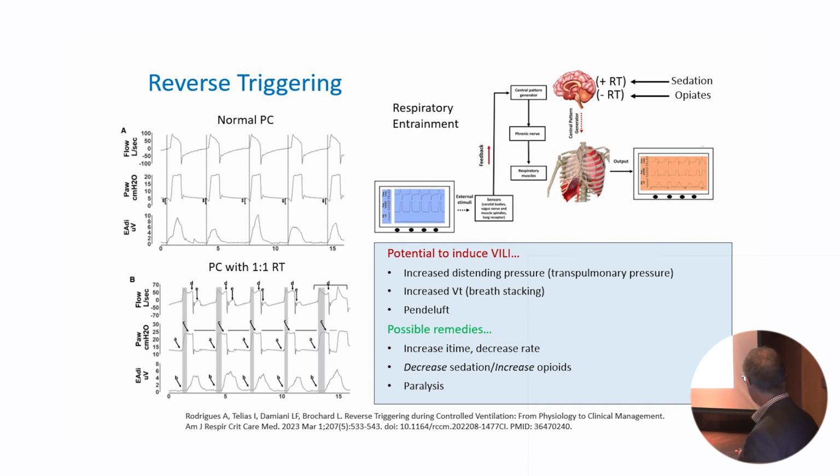But one thing you can routinely try, and I have had actually some success with this at the bedside, is that you can see here, deep sedation actually brings out reverse triggering. The deeper your sedation level, the more likely you are to have reverse triggering. And there are studies with propofol where they actually test this, where they put an esophageal balloon in and titrate the propofol to different levels of sedation and show that the incidence of reverse triggering is going up.